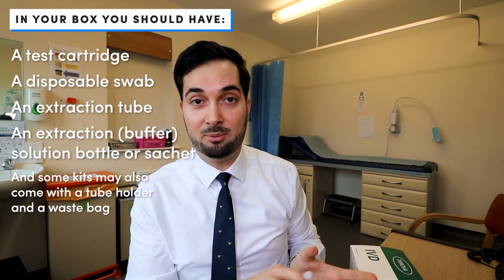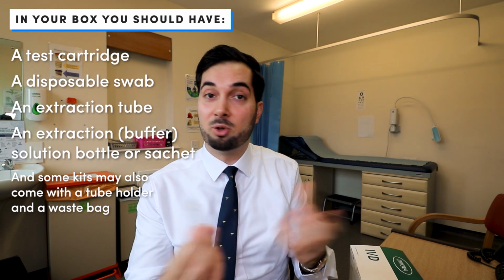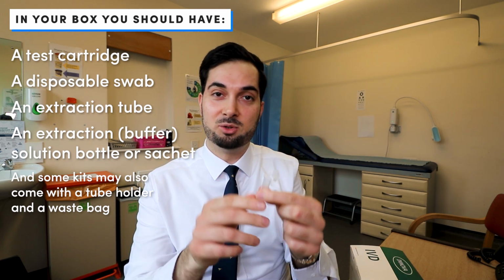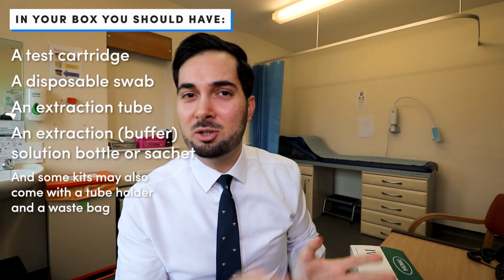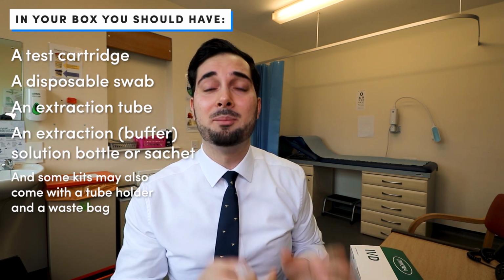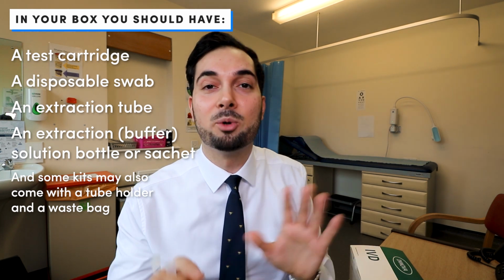It's good to have some tissue paper at hand, and if you don't have a holder, maybe get a plastic cup or whatever, and just place this in there upright when you put your extraction solution in there. I will talk about this a little later. And lastly, it would be useful for you to have a timer ready. If you don't have a timer, just use your phone, make sure it's clean, and use that as a timer, because all of this stuff is timed, but we're going to go through that.